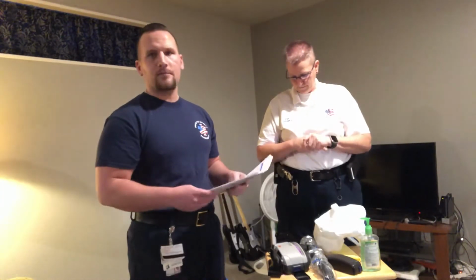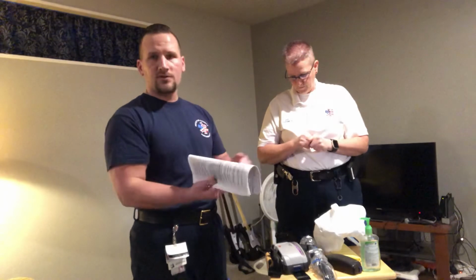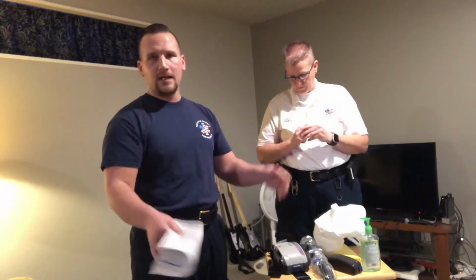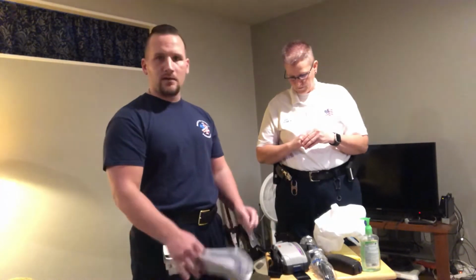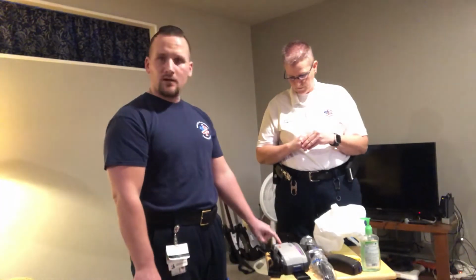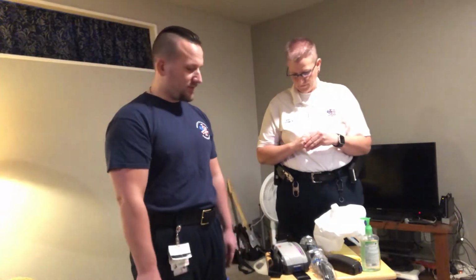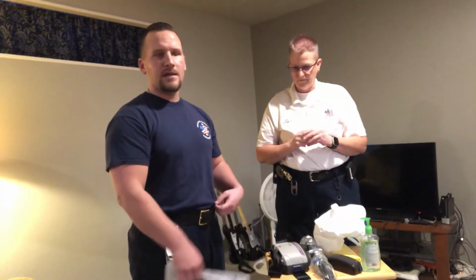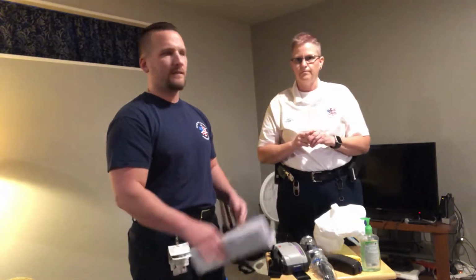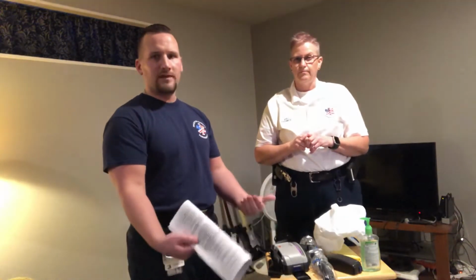just like with the LifePack, make sure this battery is either charging or charged and plugged in at all times, because there's nothing worse, and I have seen it, than getting on a COVID positive patient, going to use your trump card as far as safety goes, and realizing my battery's completely dead because it wasn't plugged in enough and didn't charge. And it's not like we have a ton of backups lying around. So in a situation like that, it can seriously delay things and put providers at greater risk for a simple thing like a battery. So please make sure it's charging, just like with the LifePacks.